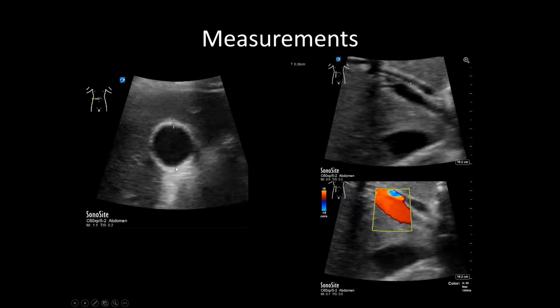Note how hyperechoic and thick the posterior wall is. This is secondary to posterior acoustic enhancement from the waves being unobstructed as they travel through the gallbladder. By measuring the posterior wall, the provider may get a falsely elevated number.